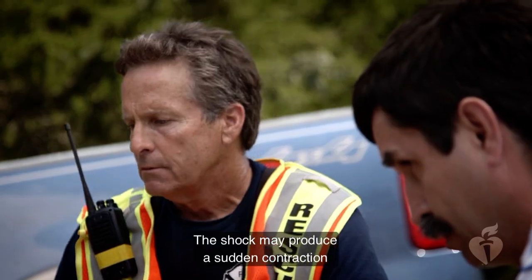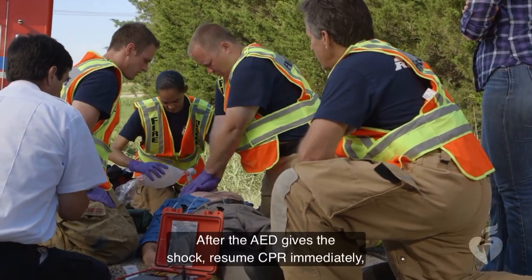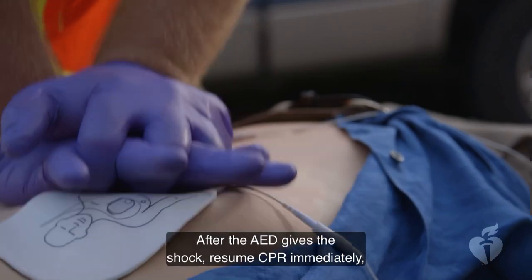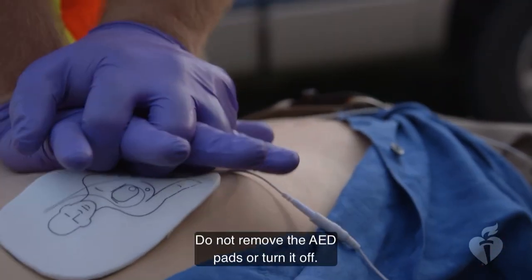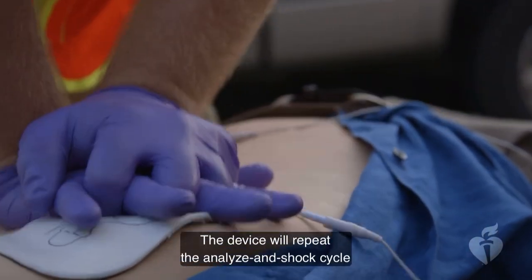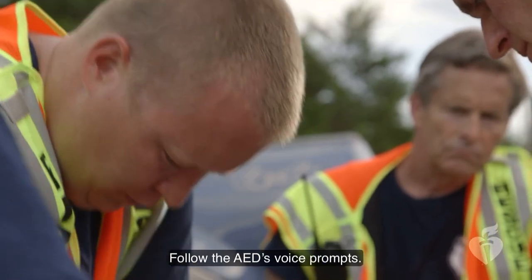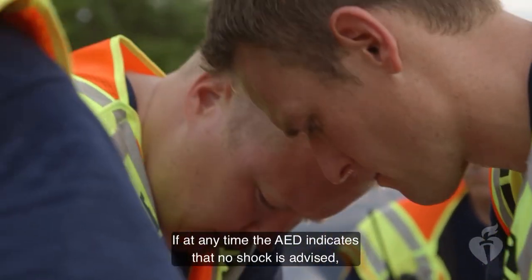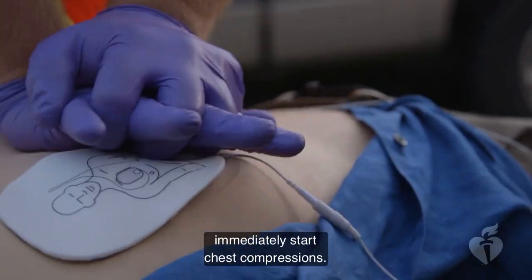The shock may produce a sudden contraction in the victim's muscles. After the AED gives the shock, resume CPR immediately, beginning with chest compressions. Do not remove the AED pads or turn it off. The device will repeat the analyze and shock cycle about every 2 minutes. Follow the AED's voice prompts. If at any time the AED indicates that no shock is advised, immediately start chest compressions.